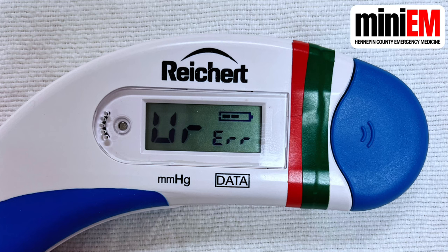Sometimes you'll get an error message on the screen. If it says UR-ERR, that stands for under error. That means the intraocular pressure was under 5, and it's probably a real error in measurement, meaning you just need to fix your technique.